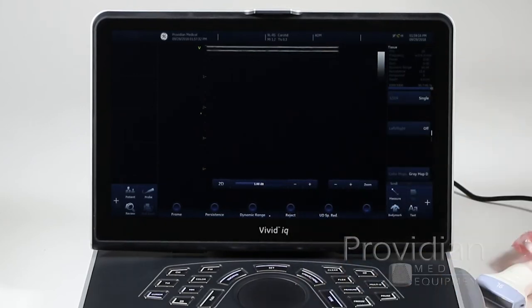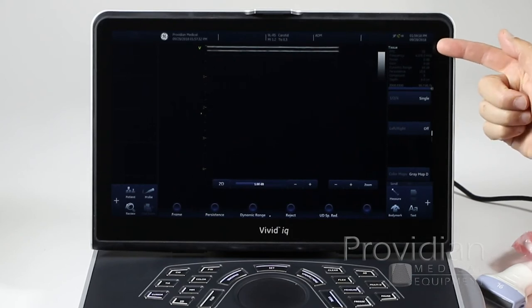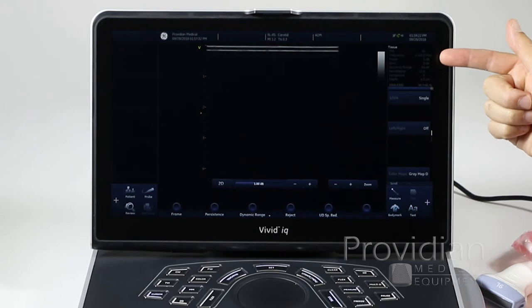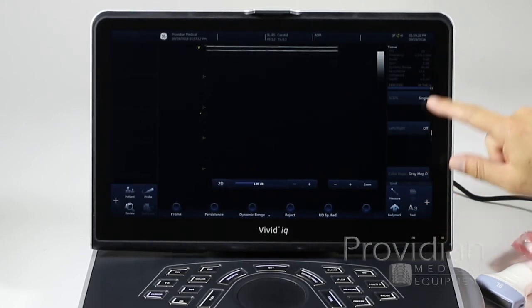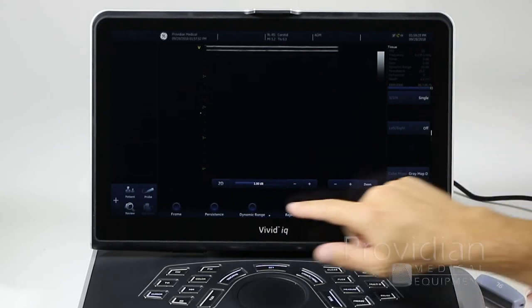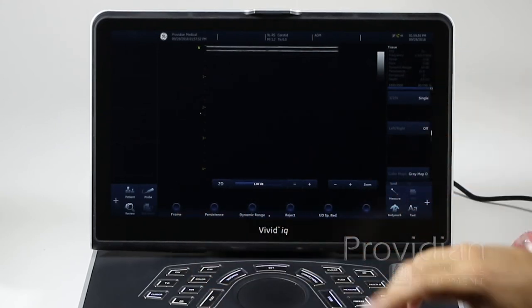Next, we have all the scanning information displayed on screen. FPS is frames per second, then your frequency, acoustic power, gain, dynamic range, and so on. You can change these through the various controls.